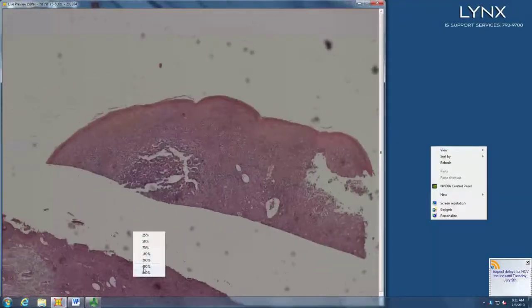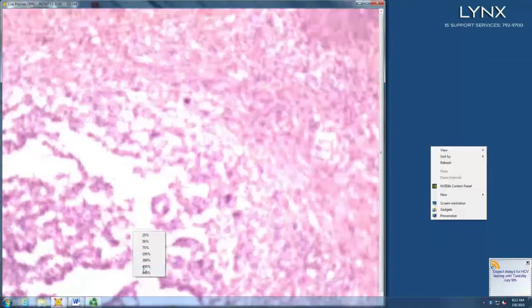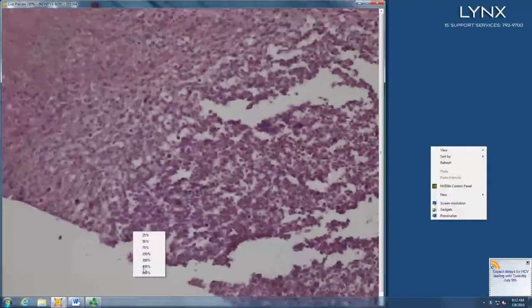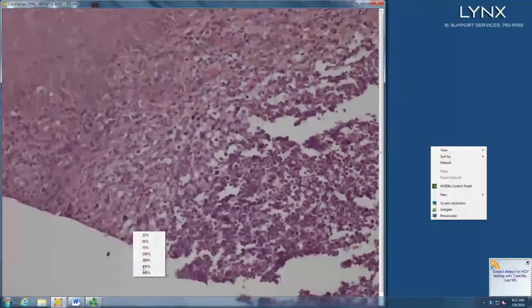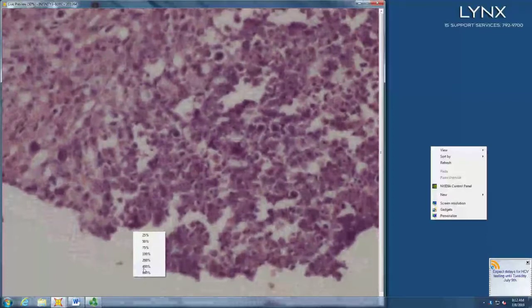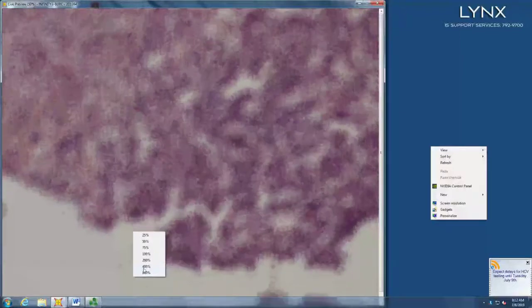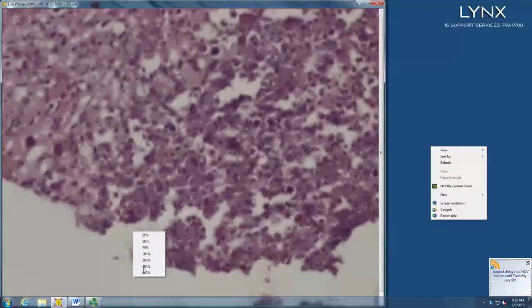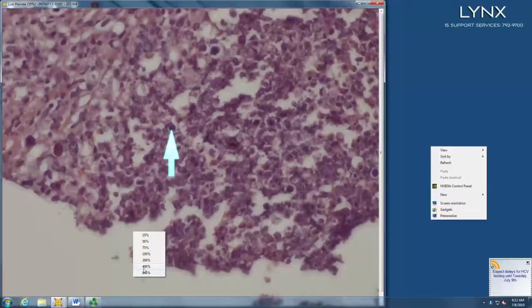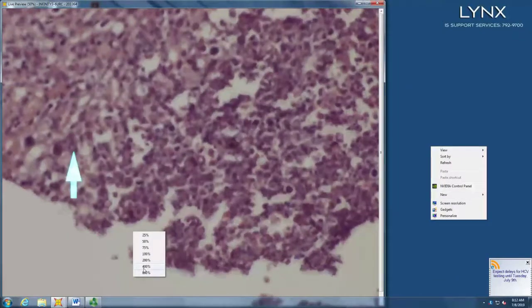Is that like a split? Looks like there's a lot of inflammatory cells. Maybe. Yeah, lots of inflammatory cells. Some not so nice looking cells. And in there is also this and that and that.